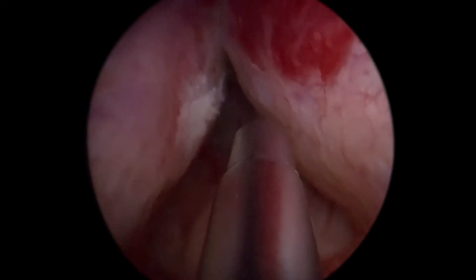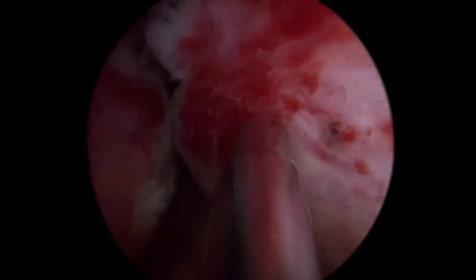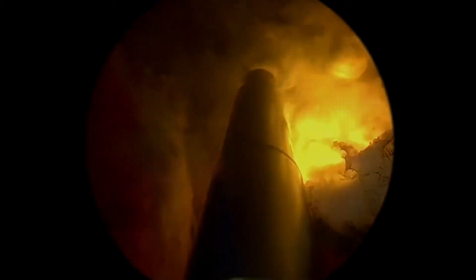Once that is gone, I turn my attention to the apex. There's often more tissue than you expect there. To remove the distal apical tissue, you look around the corner and I tend to work in a retrograde manner, away from the sphincter — starting in a safe zone and working into the prostatic fossa. I like to tell residents: work away from danger. Whatever the danger is near you, whether it's a ureteral orifice or the sphincter, work in the opposite direction.